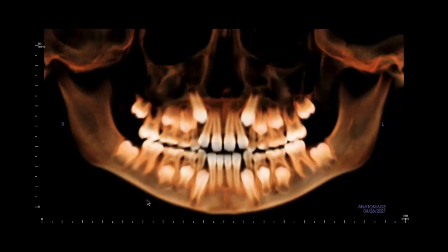Okay? There's no huge red flags. The tips of the canines are past the apices of the laterals. They're not crossing over the root at all on the upper or the lower. The eruption pattern is relatively normal. The first premolar is in front of the second premolar, in front of the canine. Like everything's kind of happening the way that it normally would. The 12-year molars, I mean, they're not at high risk for impaction. So probably if we did nothing, all of the teeth would come in.